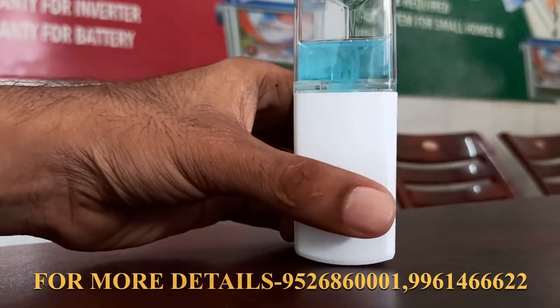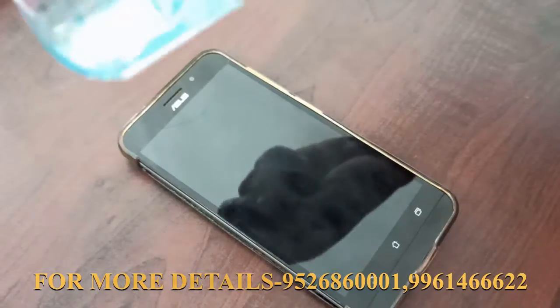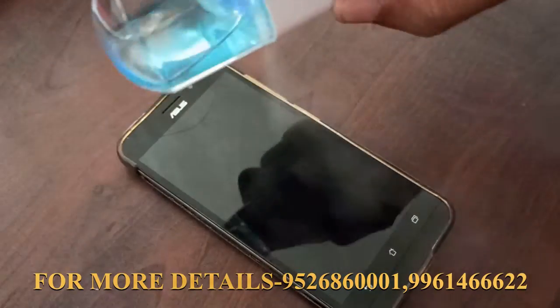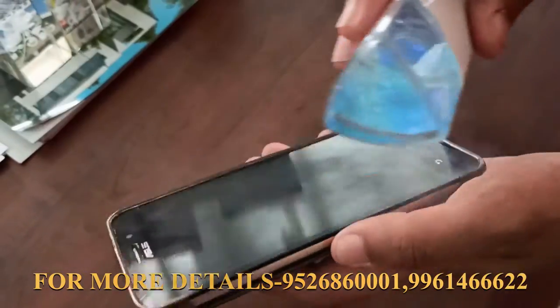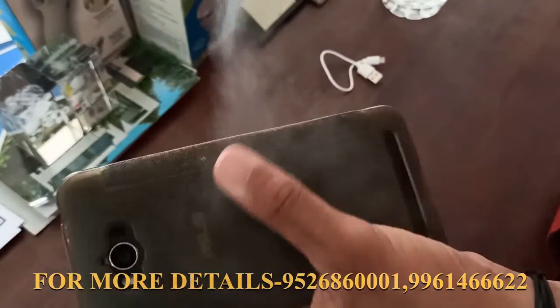We will see that our mobile can be sanitized using this device. You can place your mobile inside, and it will be sanitized.